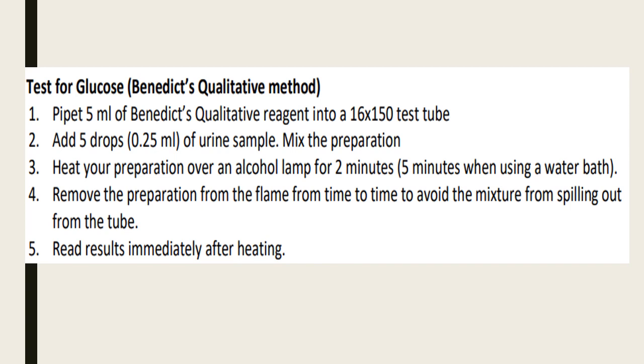You always make sure that the opening of your test tube is not pointed at you or at other people, because if you are heating urine, there is a great possibility that it will overflow. If you're using a water bath, you heat it for 5 minutes. And then, of course, remove the preparation and read your results immediately right after heating.